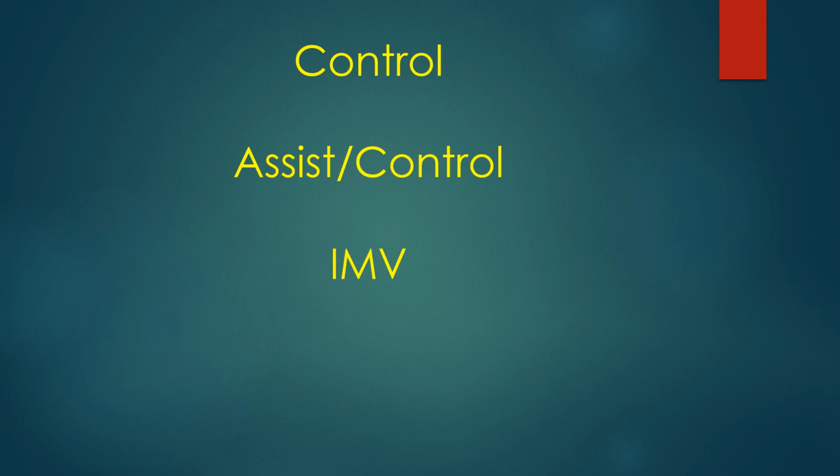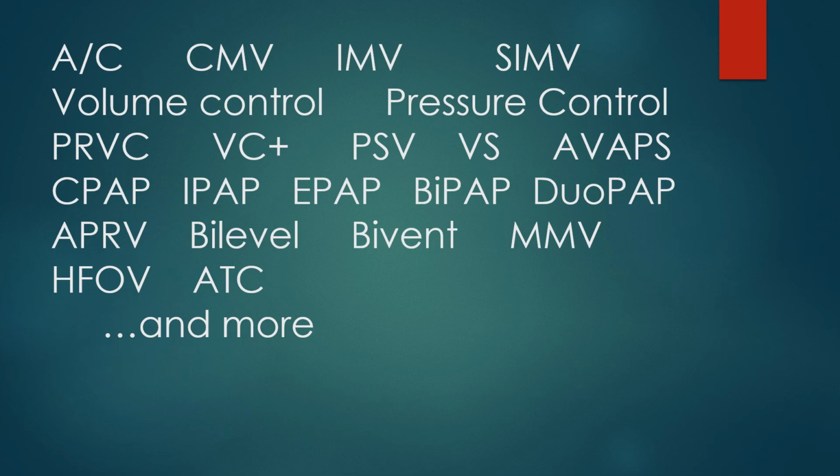When they started coming up with new ways to ventilate the patient, they would often call that a new mode or breath type, or just a new type of ventilator. So that led to a lot of confusion when you had all of this.